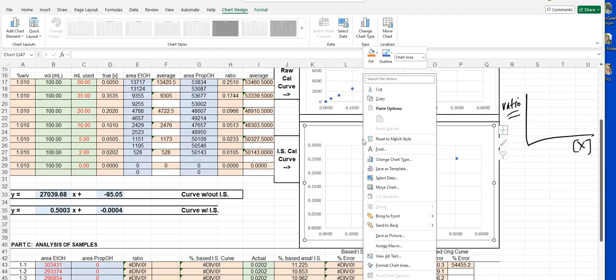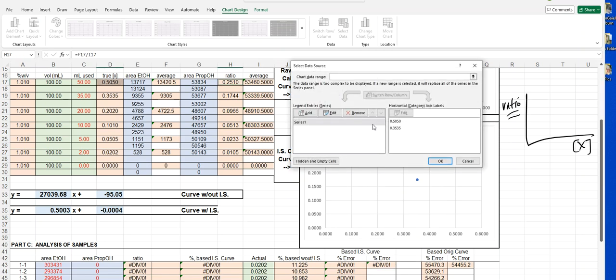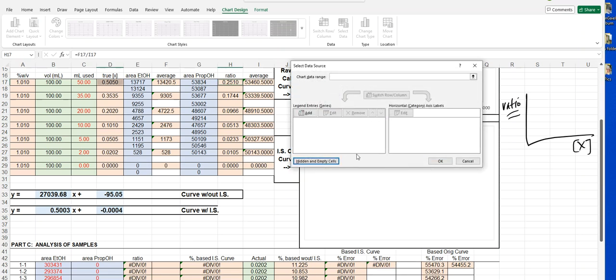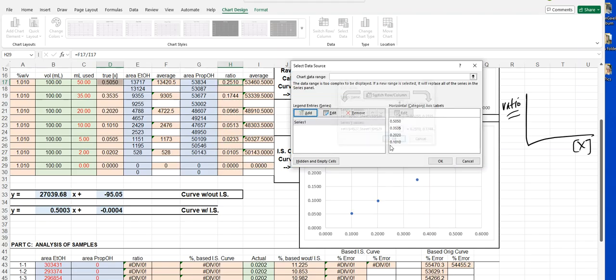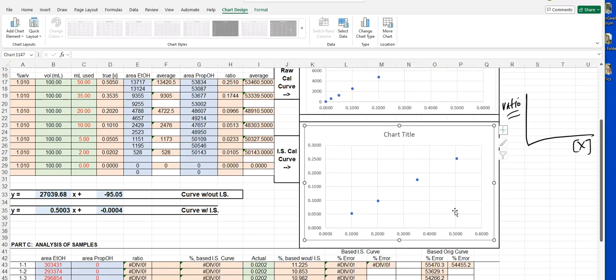Oh no. What happened? Let's do this again. Look, I've said I don't get let down, and look at what happens. Sure enough, I get let down. Maybe I just accidentally pushed a button that I shouldn't have. So we'll see. Hopefully this will work out. There we go. All right. So there are my points. That's kind of what I want to see.